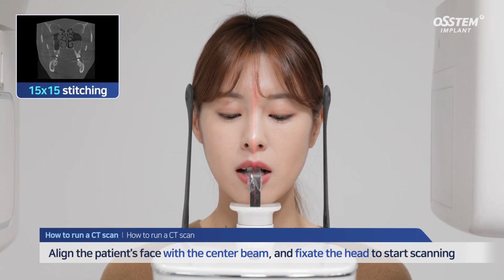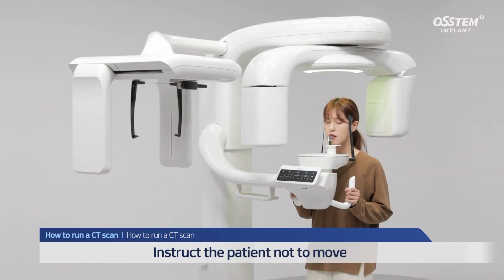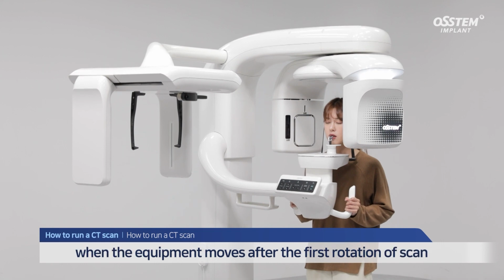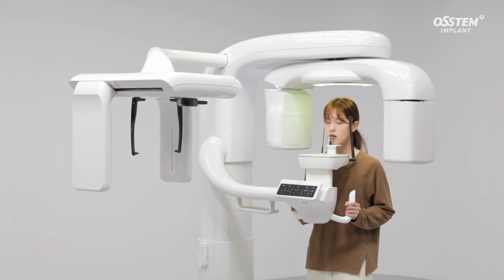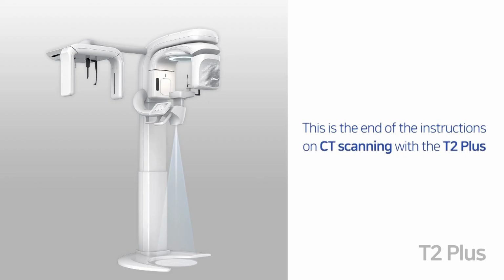Align the patient's face with the center beam, then fixate the head to start scanning. Complete the scanning process by ensuring that the patient remains still when the gantry moves after the first rotation of scan. This is the end of the instructions on CT scanning with the T2+.